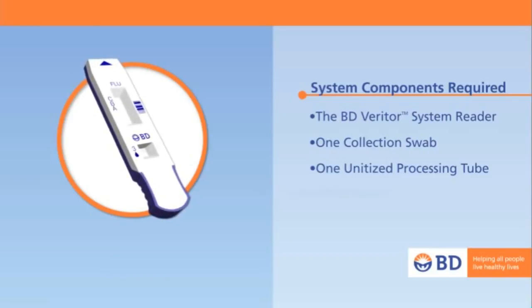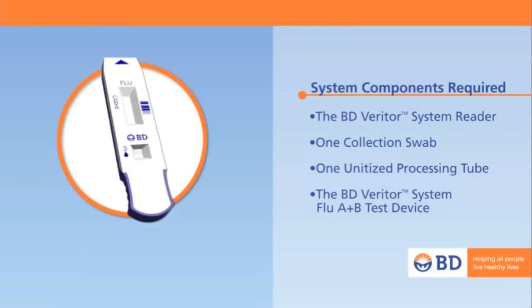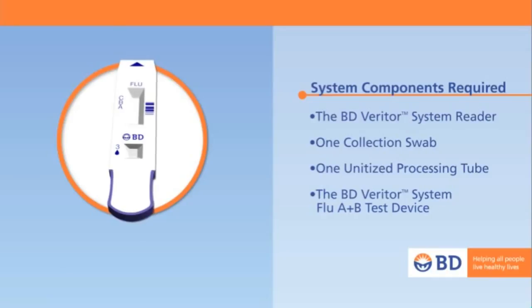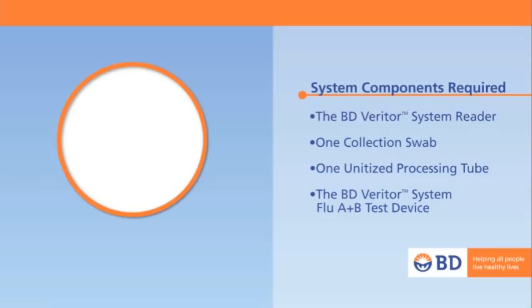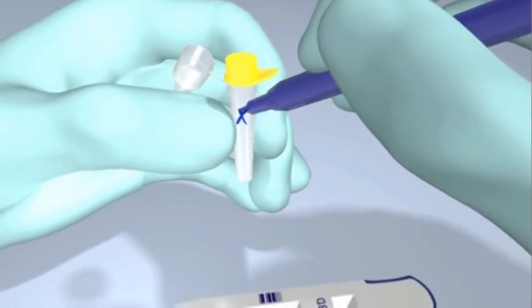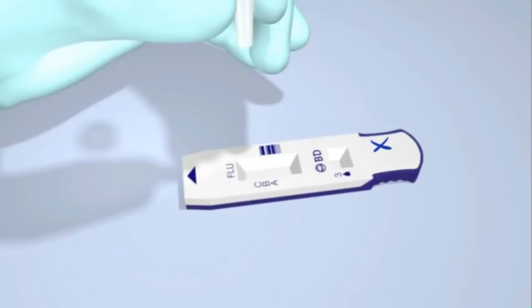You will also need one BD Veritor System Flu A plus B test device, which in combination with the BD Veritor System reader enables BD's unique adaptive read technology. Now let's walk through how to use the BD Veritor system. First, label the unitized tube and the BD Veritor System test device for the specimen to be tested.